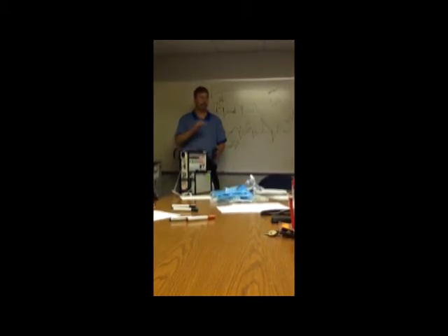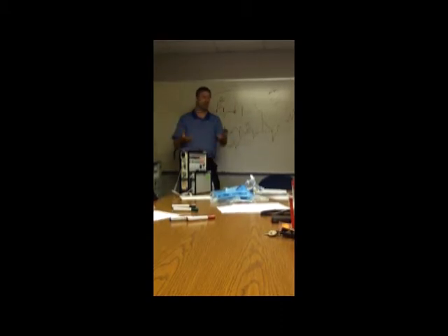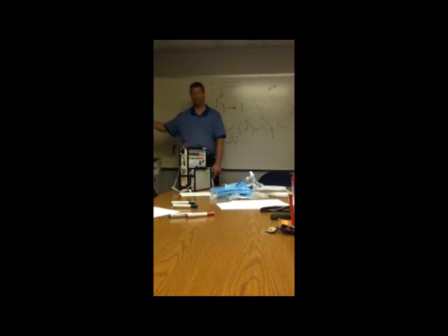If I'm sucking in real hard, it's not going to be 4% with each liter because I'm sucking in room air around it. That's the same with a non-rebreather. If you ever have somebody on a non-rebreather, make sure your tank is turned all the way up, not just 15, as high as you can get it.